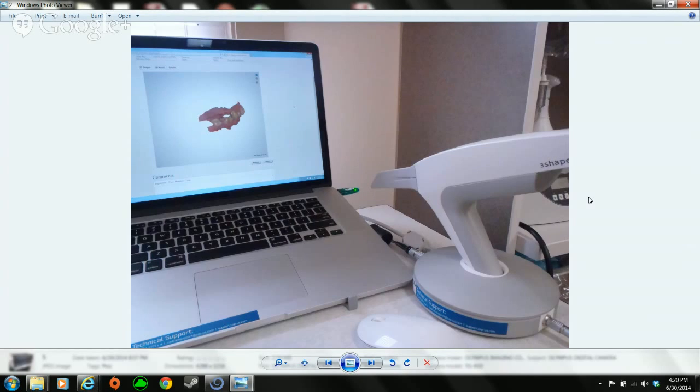Have you prepared guides for all-on-4 cases? Yes, that's mainly what we do in our office. We do about 2 a week. It's basically the same protocol, but instead of an intraoral scan of a single tooth, where it's a tooth-borne surgical guide, you're going to use a scan appliance, which is just their denture, or we prefer to start with a new denture, at least a wax-up of a denture, to get the teeth where we want them in the all-on-4. You need really good flanges with some thickness to them.